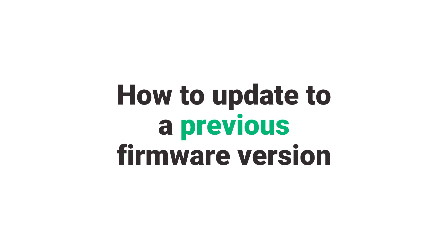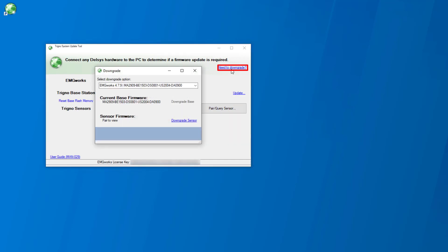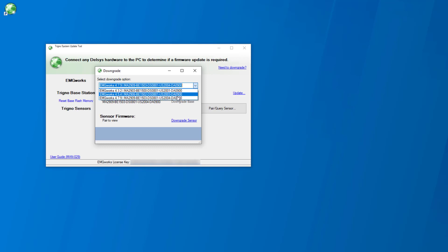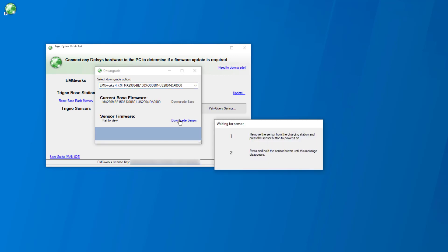How to update to a previous firmware version: To begin, select Need to downgrade in the top right-hand corner. Select the downgrade option from the drop-down menu that corresponds to the intended sensor firmware version. Click Downgrade Sensor.